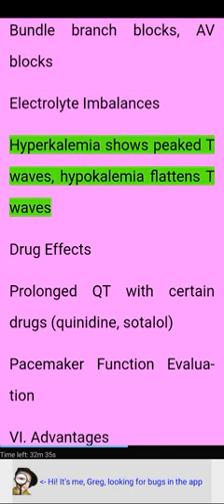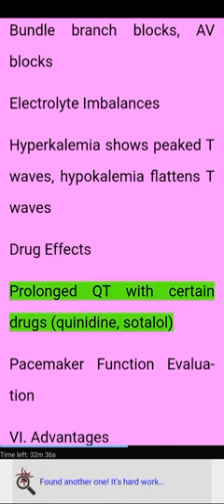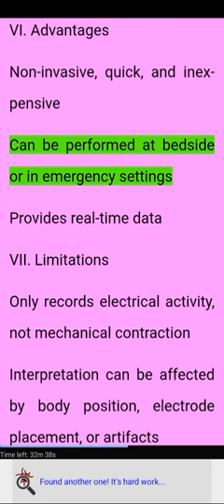Electrolyte imbalances: hyperkalemia shows peaked T waves, hypokalemia flattens T waves. Drug effects: prolonged QT with certain drugs, quinidine, sotalol. Pacemaker function evaluation. 6. Advantages. Non-invasive, quick, and inexpensive. Can be performed at bedside or in emergency settings.